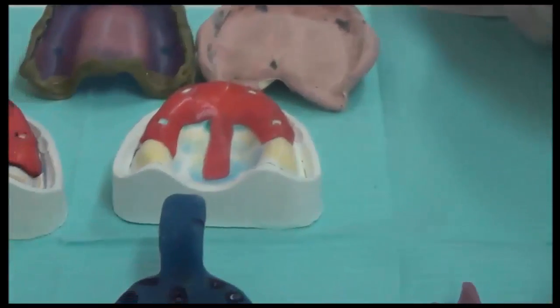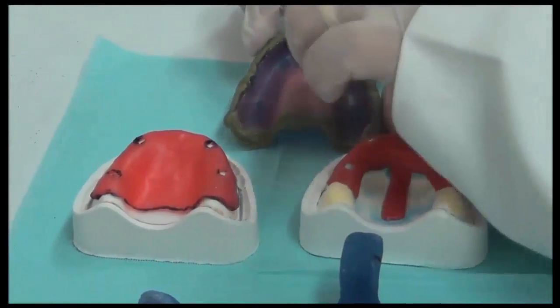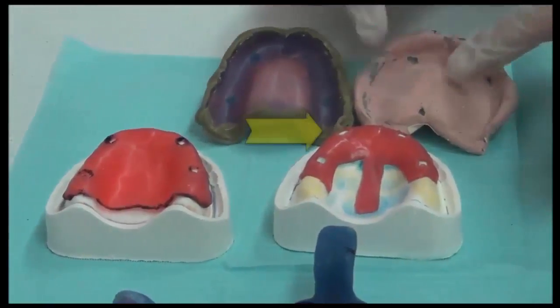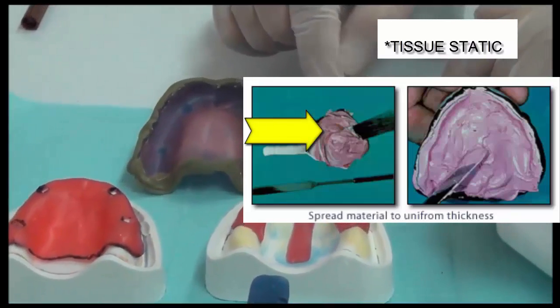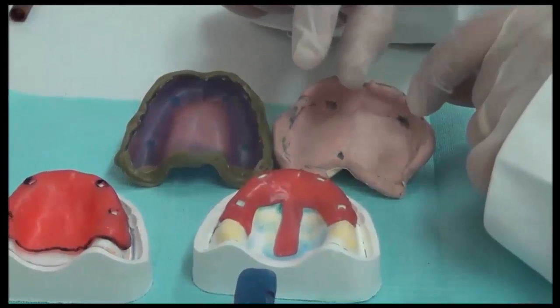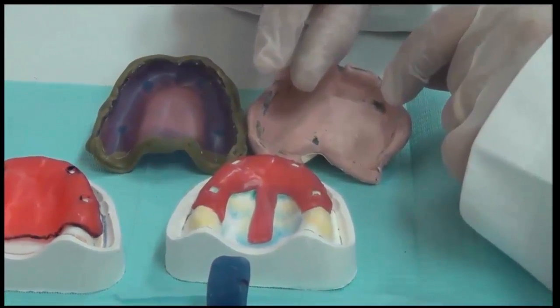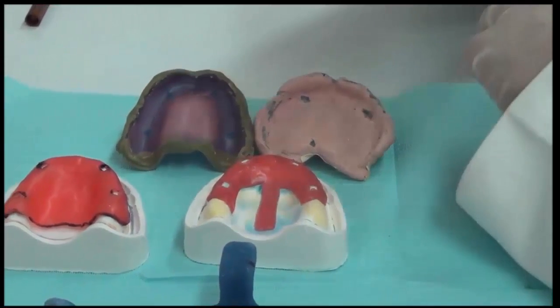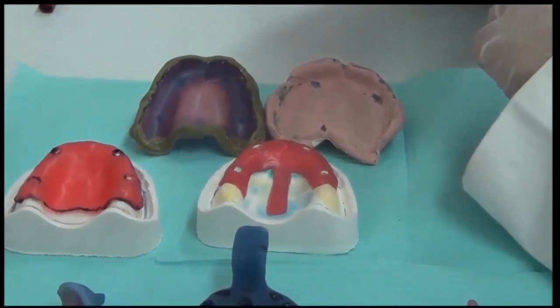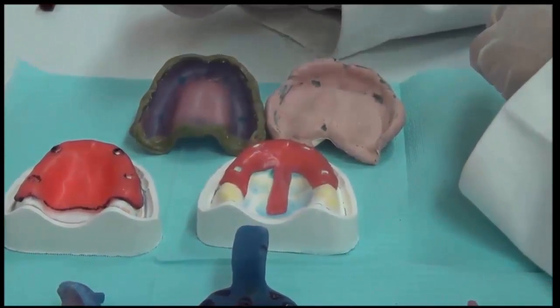But in the cases where we have a spacer, that means once we remove this spacer away, the impression material has some sufficient space inside the areas where the wax was there. This thickness of the material allows it to be mucostatic, meaning that it does not press the tissue away from its resting position. So you record the tissue at the rested position.